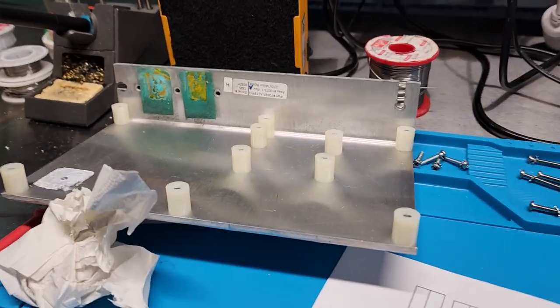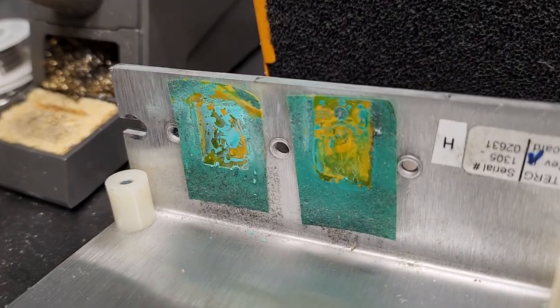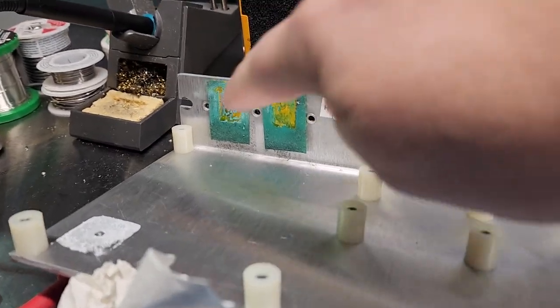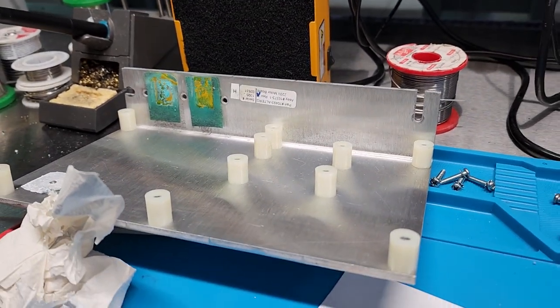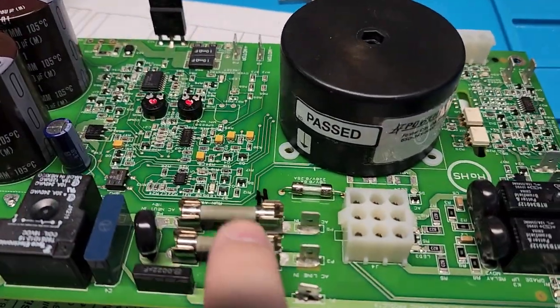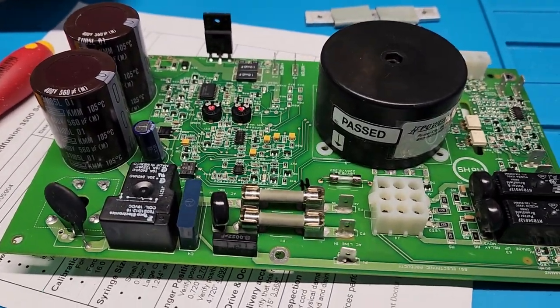Okay, so first off, you can see I removed it from its chassis, and obviously one of the things we have to do is release the MOSFETs from the heatsink, and you can see that does not look healthy. The thermal compound, whatever thermal conductivity it had, is clearly gone, and that immediately makes me suspect, because one of the things that happened on this board is we had an open fuse. So if you have an open fuse, something shorted, guaranteed.